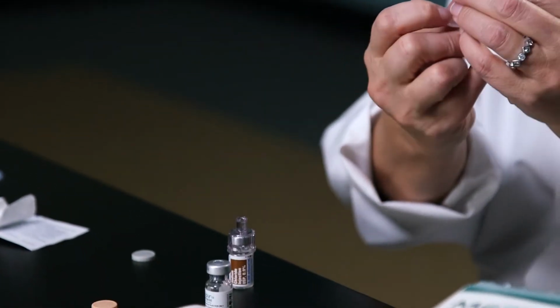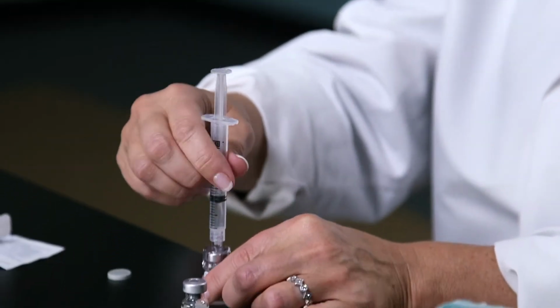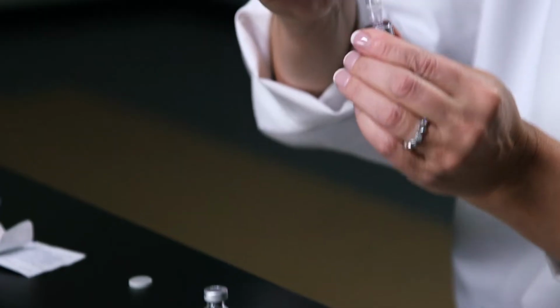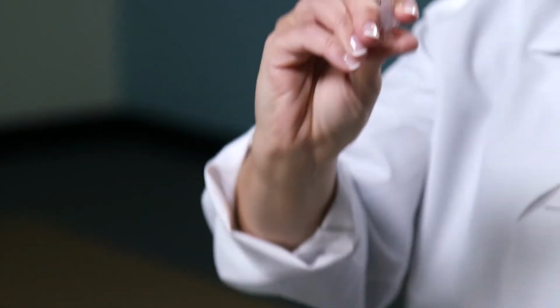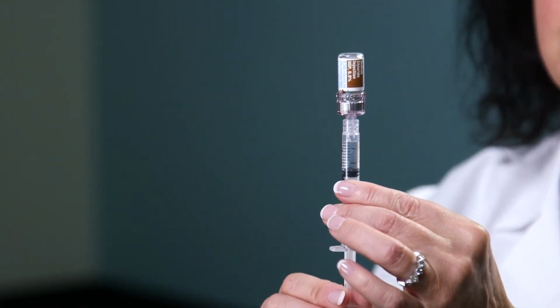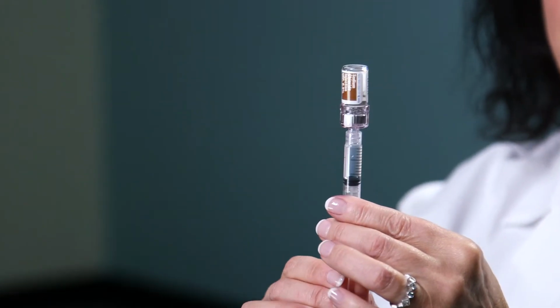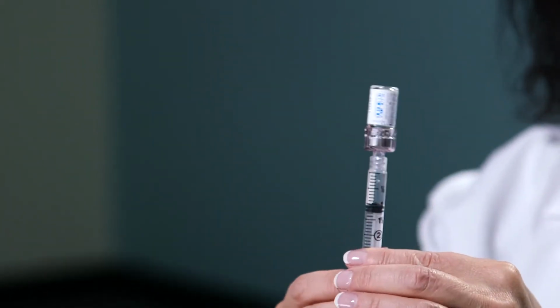Take your syringe and pull the plunger down to the 1 ml mark. Screw it on to the Q-cap. Inject that air into the sodium chloride. Turn the vial upside down, and it will almost push itself back out. You're going to pull back to the 1 ml mark. The sodium chloride vials contain 2 mLs.